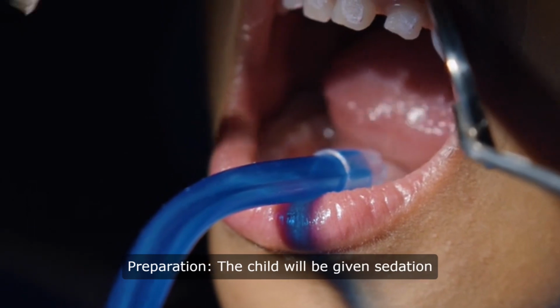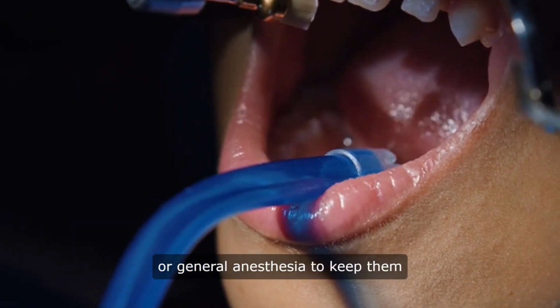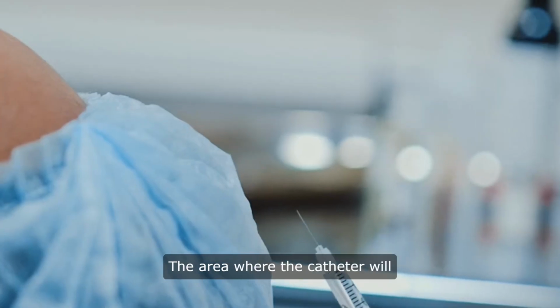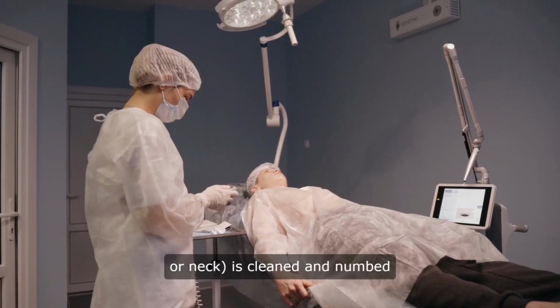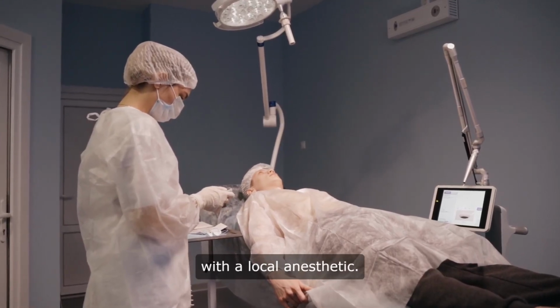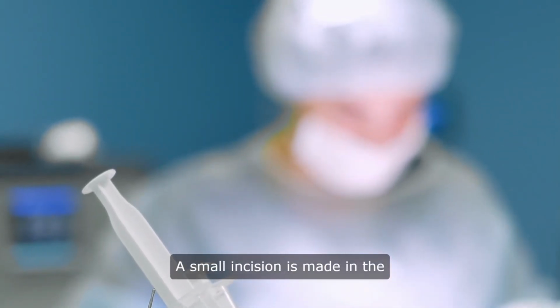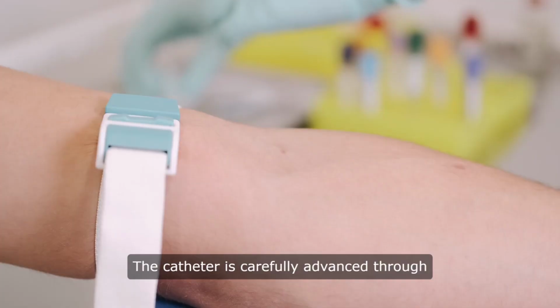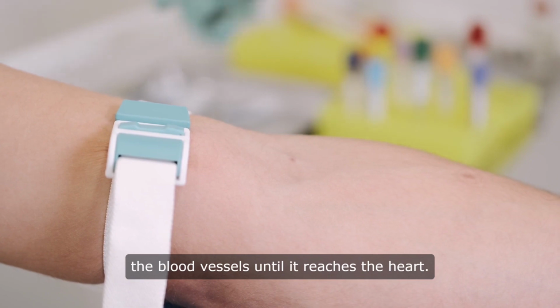Procedure. Preparation. The child will be given sedation or general anesthesia to keep them comfortable and still during the procedure. The area where the catheter will be inserted, usually the groin or neck, is cleaned and numbed with a local anesthetic. Insertion of the catheter. A small incision is made in the skin and the catheter is inserted into a blood vessel. The catheter is carefully advanced through the blood vessels until it reaches the heart.